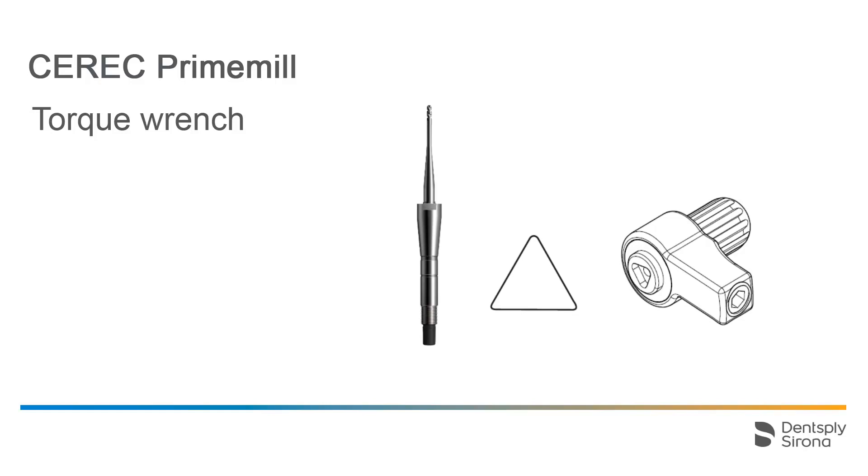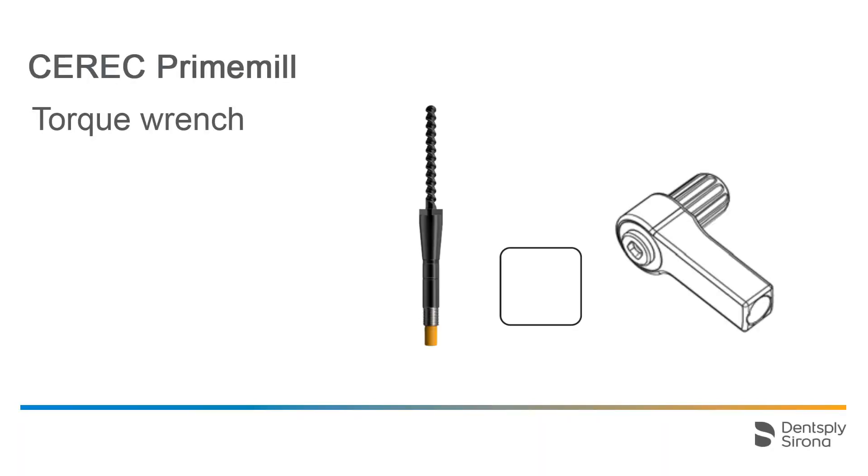Most of the instruments, such as the Burr 1.0 CS displayed here, are inserted and removed using the torque wrench with the triangular connection. The Burr 2.5 CS for zirconium oxide blocks, which is displayed here, requires a higher torque than all the other instruments. This can be achieved using the torque wrench with the square connection. The instrument mirrors the respective shape.